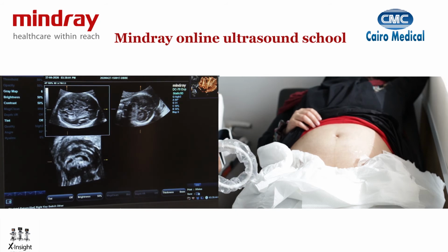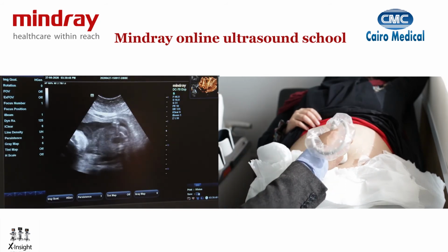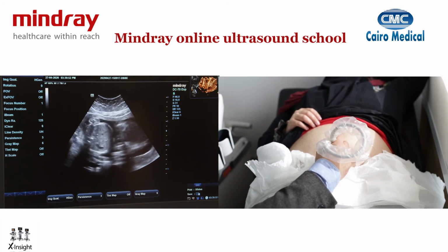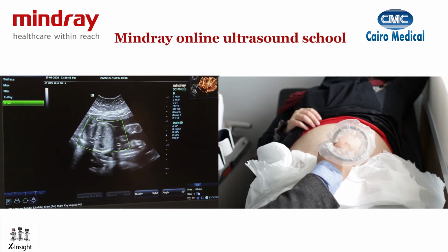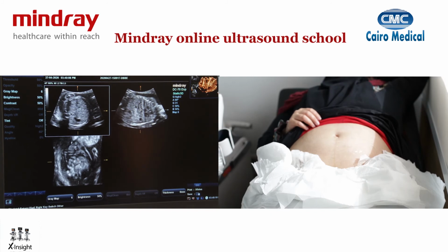Okay, let's do one more example of multiplanar imaging, for instance, across the baby's stomach. So let's take a view of that. So I'm going to be taking a 3D image of the baby's stomach. And I'm going to show you how I'm going to utilize that. So now I've taken a multiplanar image of that. So in that view, you can actually see the different structures.